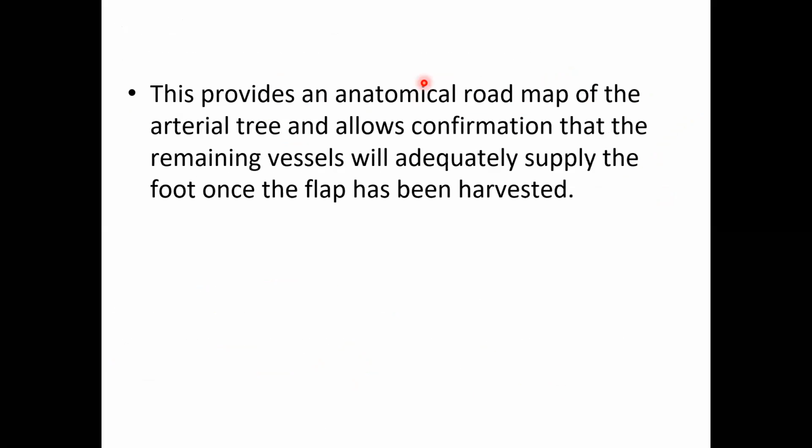This provides an anatomical roadmap of the arterial tree and allows confirmation that the remaining vessels will adequately supply the foot once the flap has been harvested. So as you could see, confirmation that remaining vessels will adequately supply the foot. Whatever is the remnant, that will be supplying the foot.